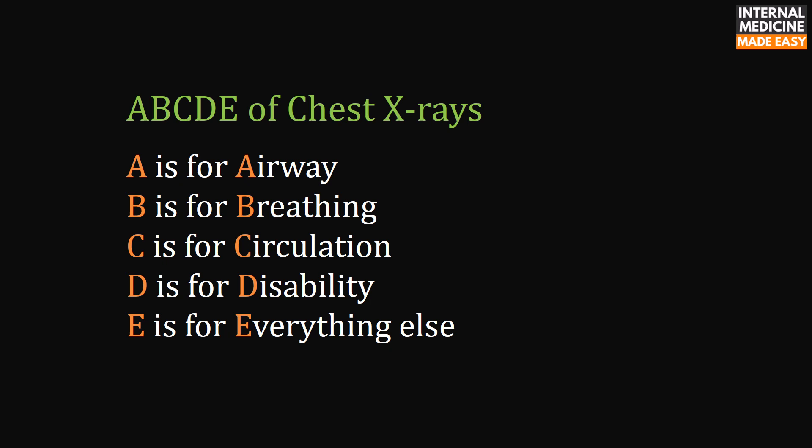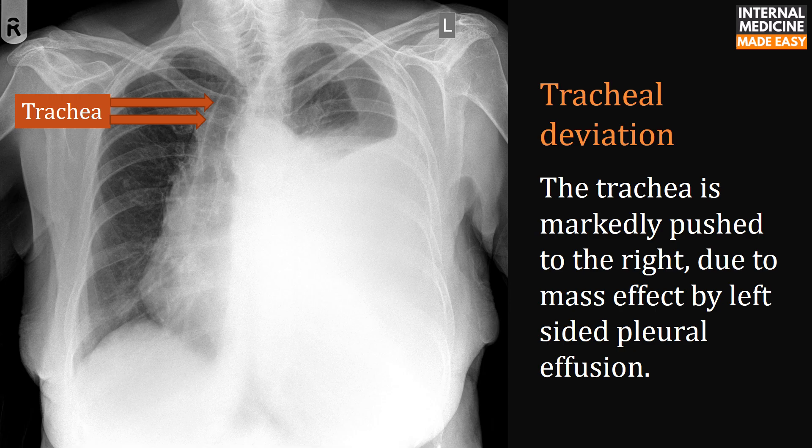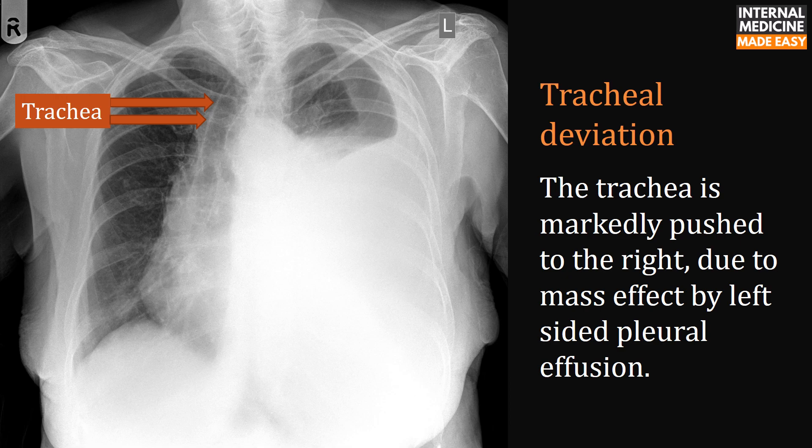The ABCDE of chest x-rays: A is for Airway, B is for Breathing, C is for Circulation, D is for Disability, and E is for Everything else. For Airway, look at the trachea, right and left main stem bronchi, and intermediate bronchus. What to look for: tracheal deviation and carinal angle. In one x-ray, the trachea is markedly pushed to the right due to mass effect from left-sided pleural effusion. The subcarinal angle (shown by a yellow solid line) is also enlarged, much more than the upper limit of normal of 90 degrees.